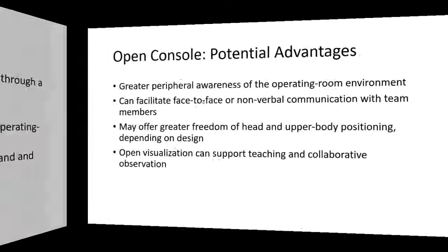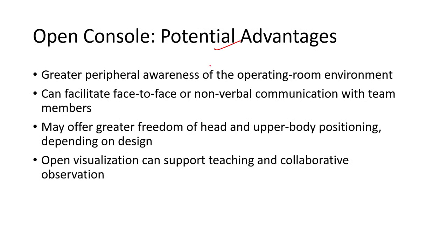When it comes to the potential advantages of the open console, there is greater peripheral awareness of the operating room environment. The surgeon can see what is happening inside the operating room and how the robotic arms are moving, not only the instruments in the operating field.